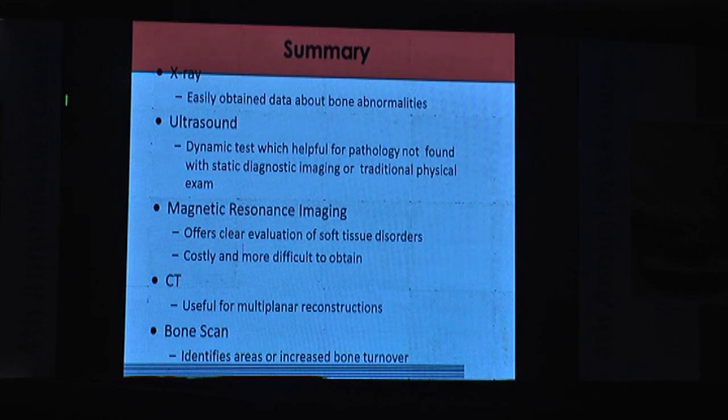So the summary is that depending on the patient and your condition, you will do the X-rays, but weight bearing is the stress that I make. I always take a weight bearing view.